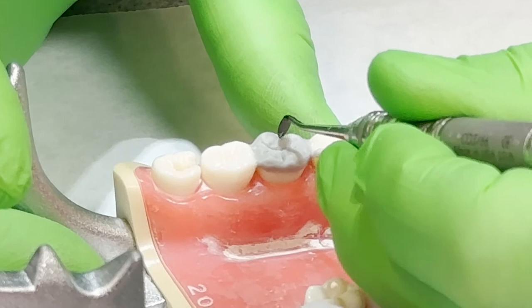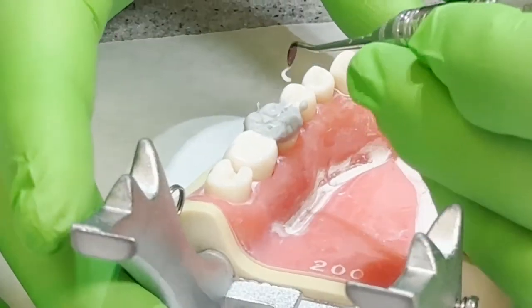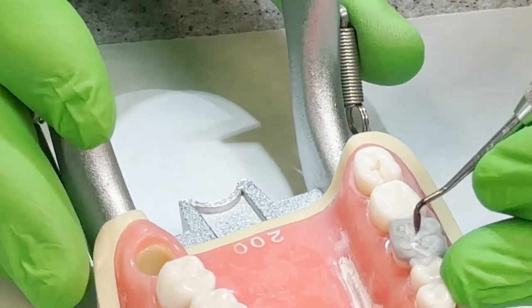And this mesial buccal cusp is going to be a little bit bigger, and that's your biggest cusp, remember. And then we want to develop a fossa area and a fossa area here.